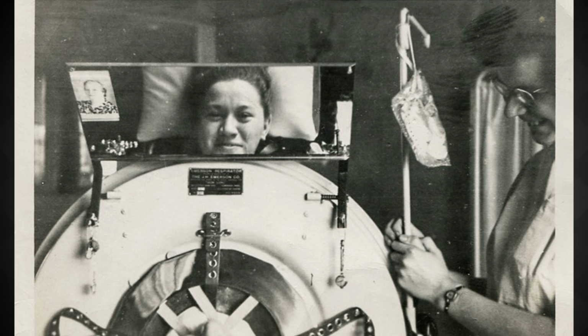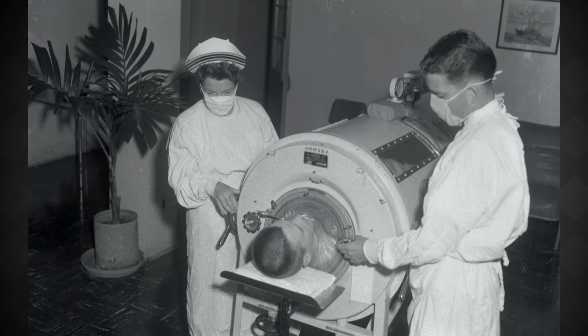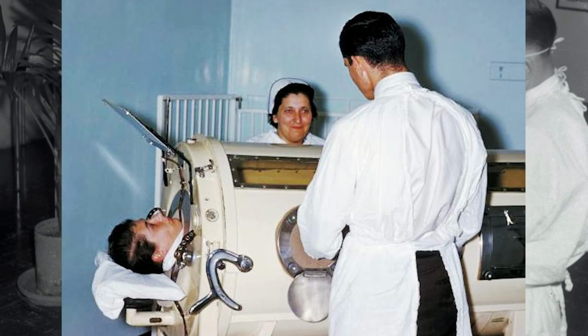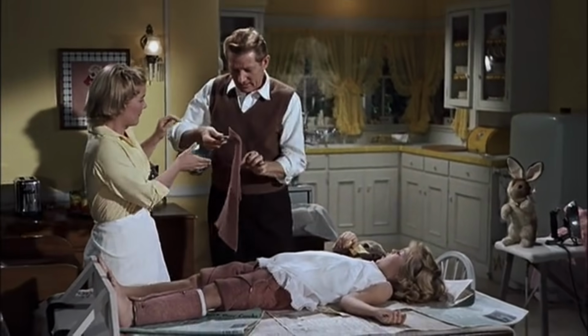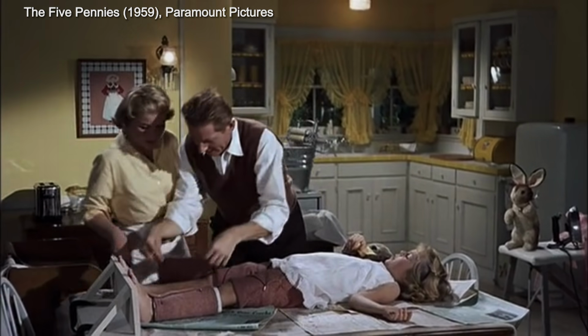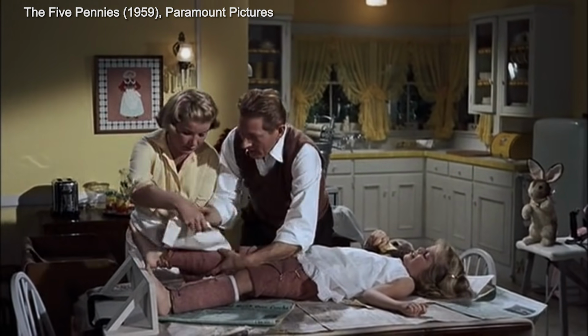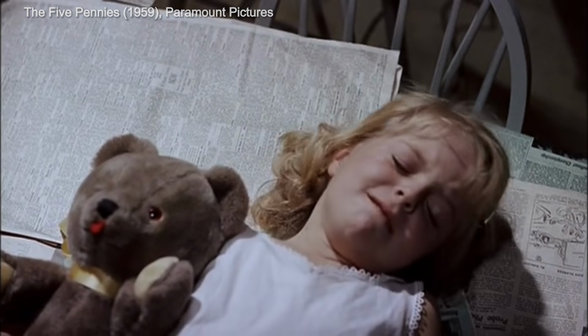Patients had to learn how to rely on others to tend to the most basic of human needs. Arms were confined inside a chamber that worked mostly by remaining nice and sealed. Opening the portal windows along the sides to move an arm and a leg or apply hot packs to an achy body could lead to respiratory distress. Patients had to be helped to use the bathroom. Sounds like a great experience overall for everyone involved.